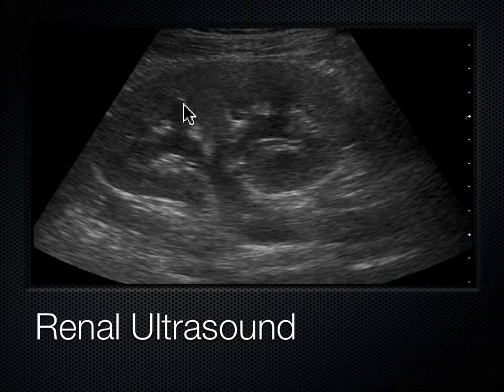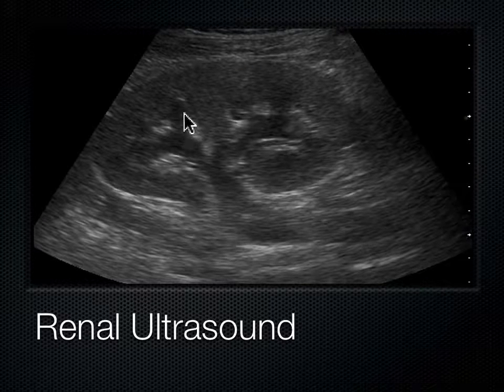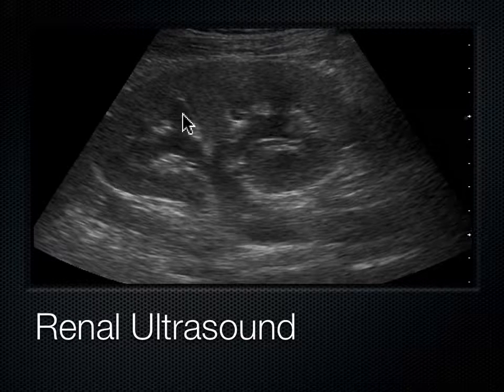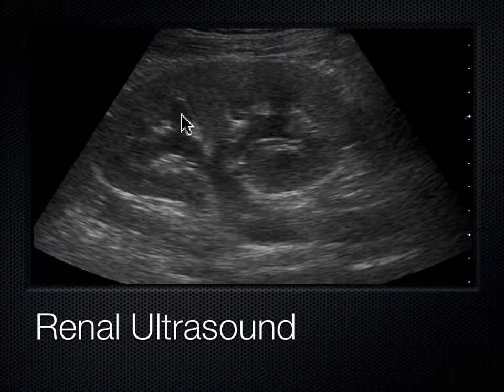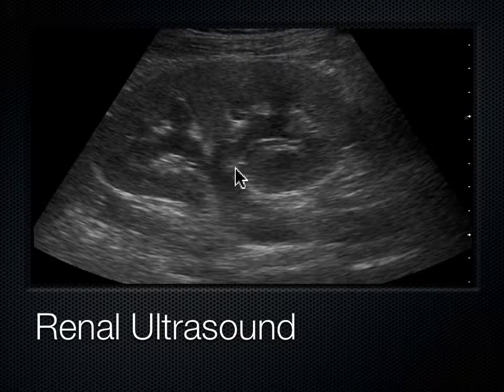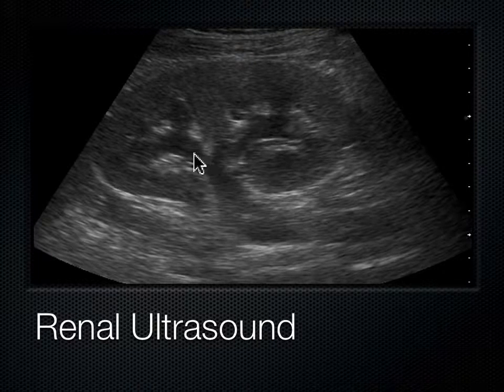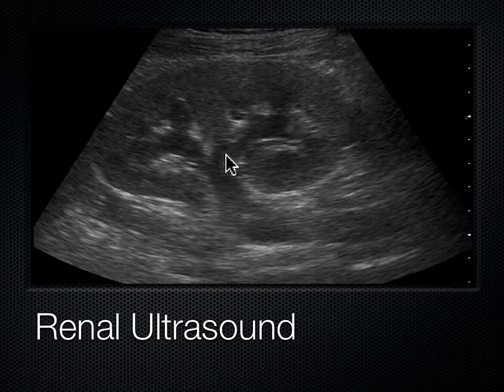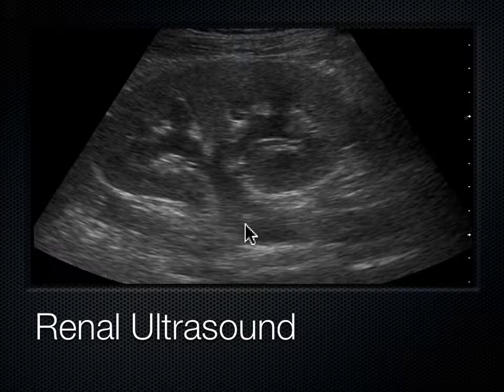You've got the cortex, then you've got the pyramids. The pyramids look basically black or anechoic because they're full of fluid or urine, and that's why they look black. These pyramids coalesce and drain into the renal pelvis, or sometimes called the sinus of the kidney. This is why it's anechoic—there's more fluid coming there—and eventually they exit out the kidney and into the ureters.